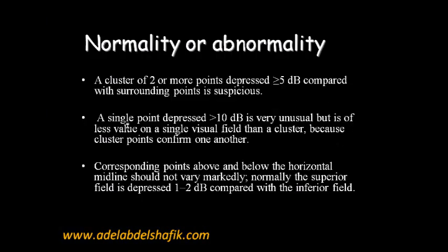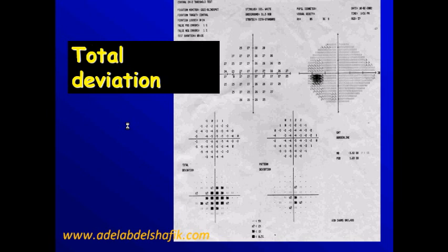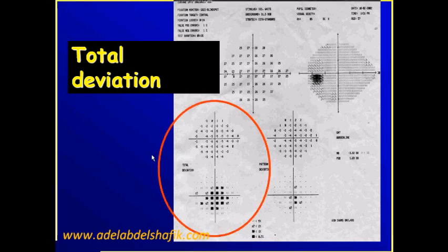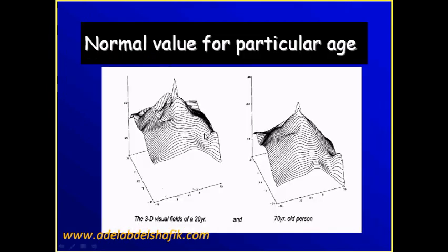Now we come to this area of the printout, which is known as the total deviation. Here we get the actual sensitivities of the patient, and here we get the numbers we call the total deviation. Normally, the sensitivity of the retina varies with age. When starting the machine, we need to enter the date of birth of the patient so we know their exact age.